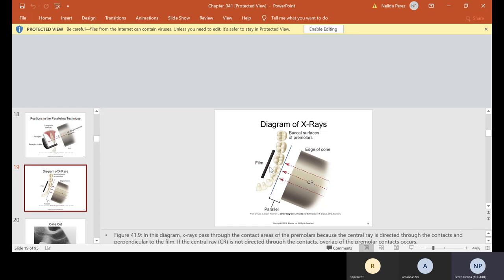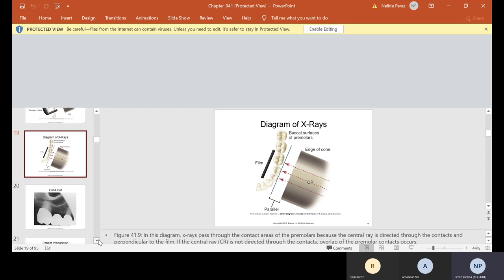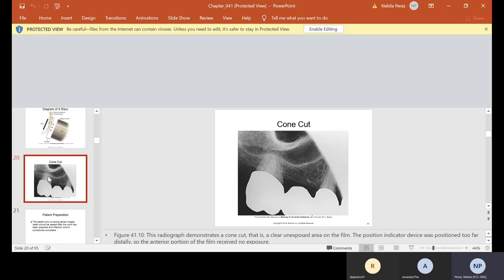If you're not parallel, you're going to get cone overlapping — you have to make sure it's dead in the circle. You also might get something called cone cutting. Here is a picture of cone cutting — this is where the circle hole of the PID is not on your target of the XCP ring, so you missed a corner and that's why it's all white. I want to point out this is a bridge — this is an abutment, this is the pontic, the missing tooth, and this is the other abutment.